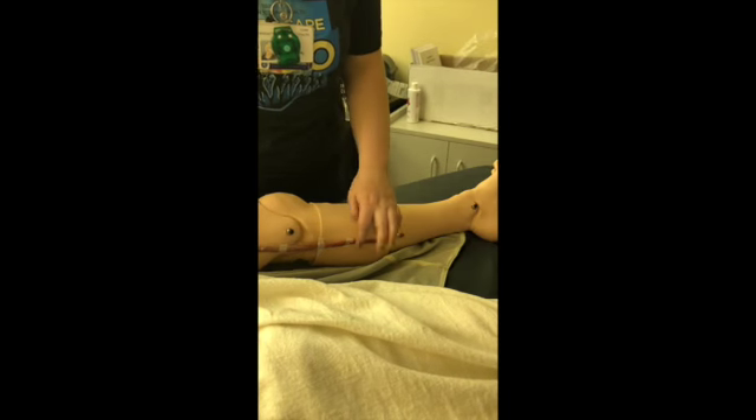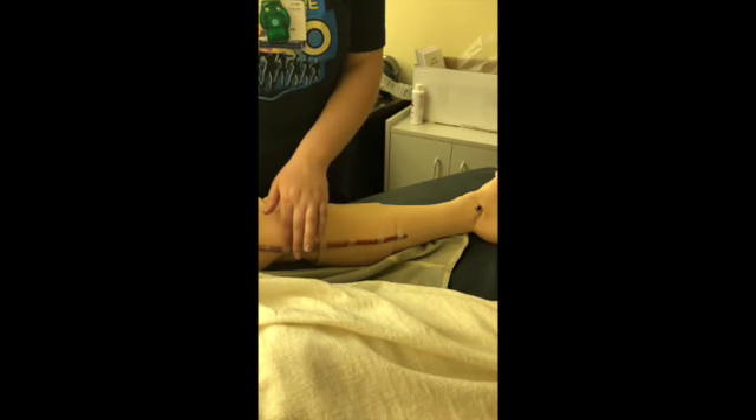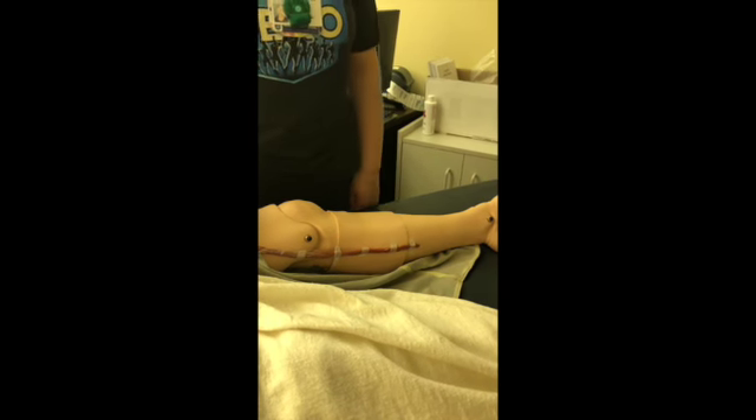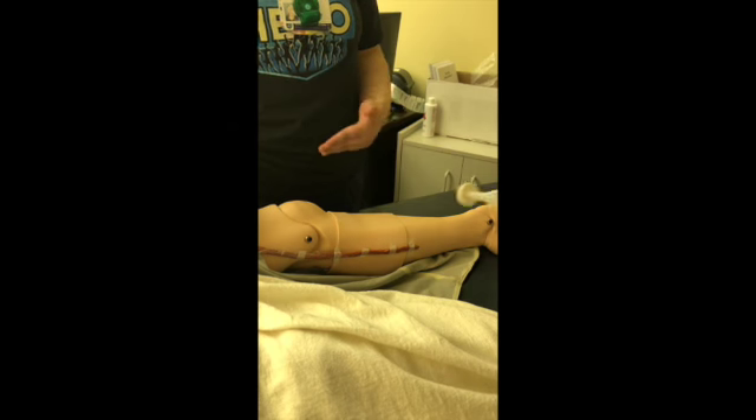As you can see here, these are the steri-strips. These do fall off on their own. We instruct the patient not to take them off.